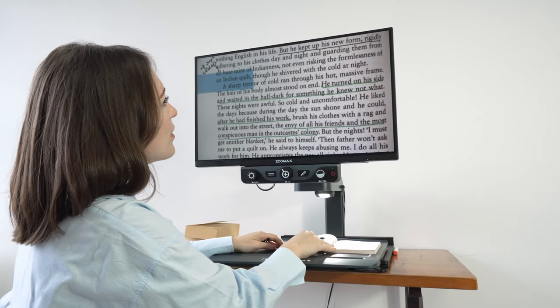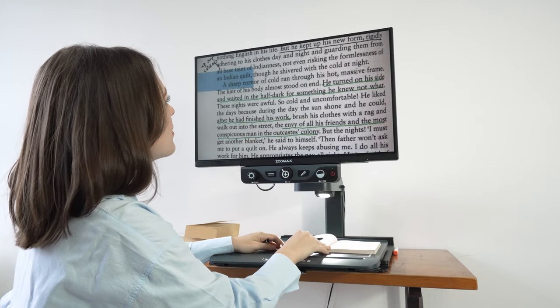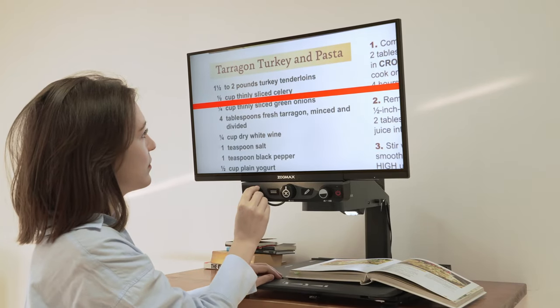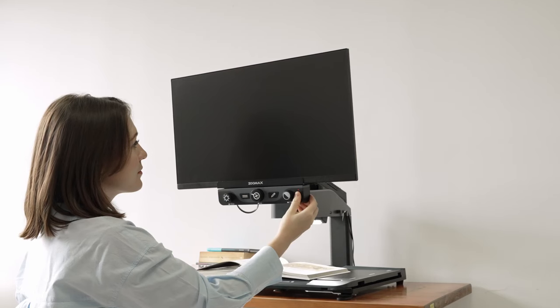Luna HD 24 Pro is designed to be easy to use. Kids age 10 or people over 80 years old can get the device under full control in minutes. Just plug in and press the power button to turn it on.